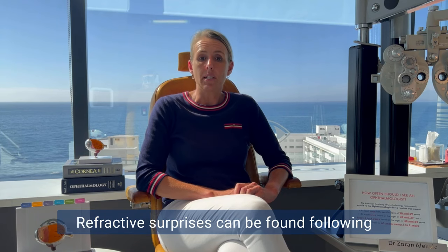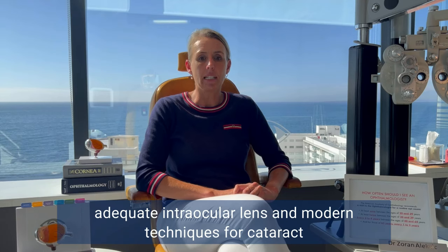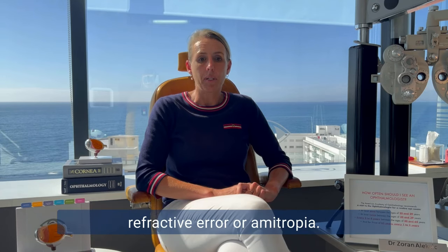Refractive surprises can be found following cataract surgery and refractive lens exchange. Accurate biometric analysis, selection and calculations of the adequate intraocular lens, and modern techniques for cataract surgery all contribute to achieving the goal of cataract surgery as a refractive procedure with no refractive error or ametropia.